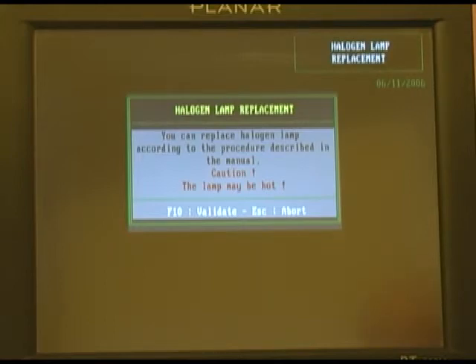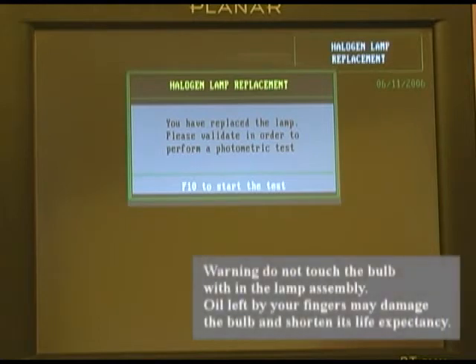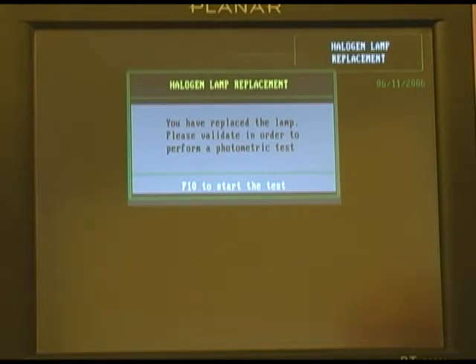You may see this warning, especially if you've been running the instrument, that the lamp is hot. And if that's the case, you may want to wait several minutes to give the lamp a chance to cool off so it can be safely handled. Hit F10 to continue. Physically access the halogen lamp, remove the lamp by pulling on it firmly, and replace it with the new lamp, being careful not to touch the lens or the bulb. This may leave residual fingerprints or oil on the lamp or housing and will cause the lamp to degrade more rapidly. Hit F10 once you've completed this task.